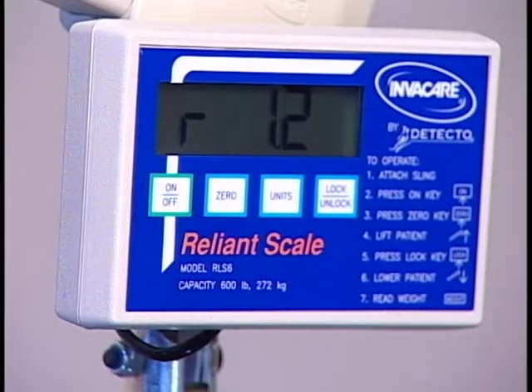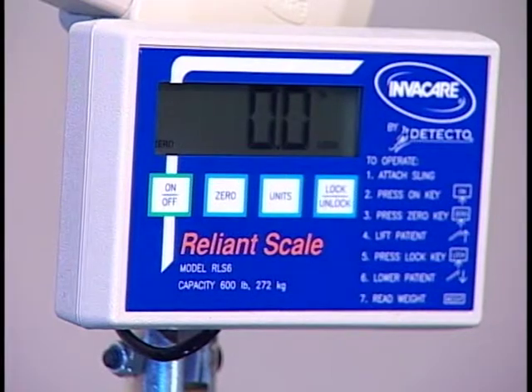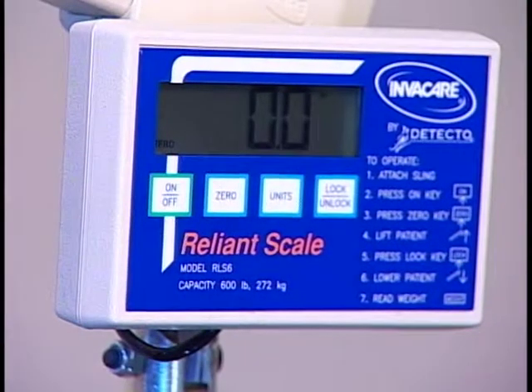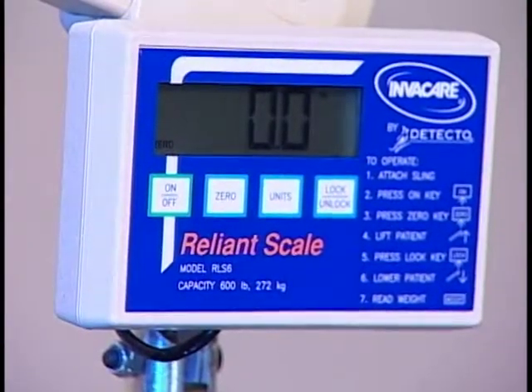Then press the ON-OFF key. This turns the scale on. Press the ZERO key. The word ZERO will appear in the display window. The scale is now reset and ready for use.